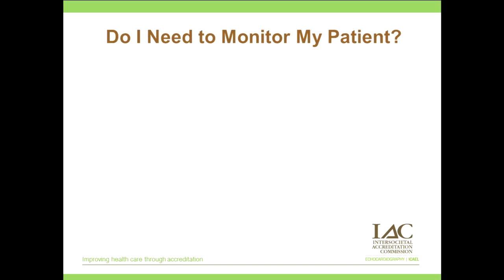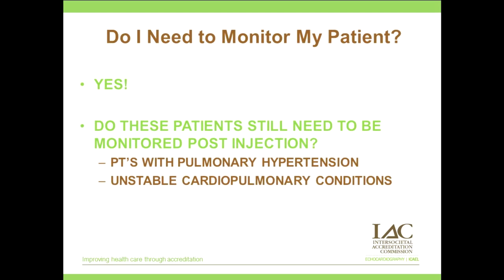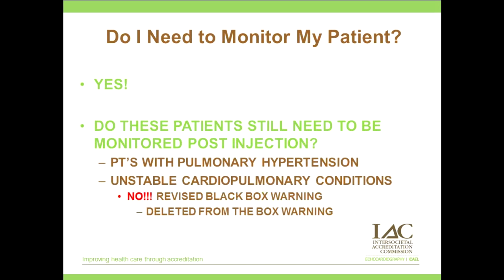Another question that is asked is about patient monitoring. Do I need to monitor my patient? And the answer is yes. All patients need to be observed for hypersensitivity reactions. Labs also need to be able to handle the adverse event that could potentially lead to resuscitation. But what is not needed now is the additional monitoring that's 30 minutes post-injection on patients with pulmonary hypertension or unstable cardiopulmonary conditions. This was deleted from the box warning.